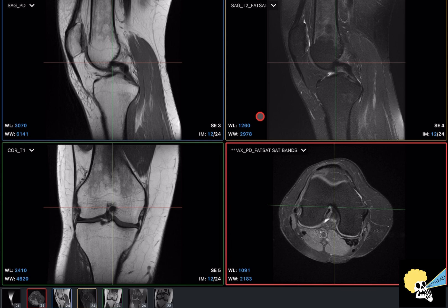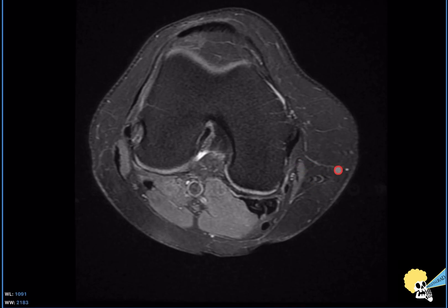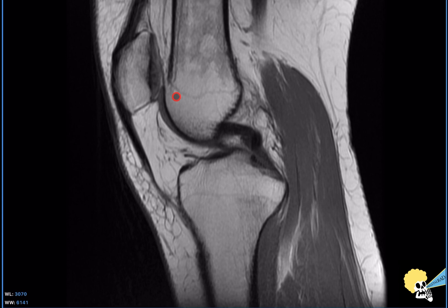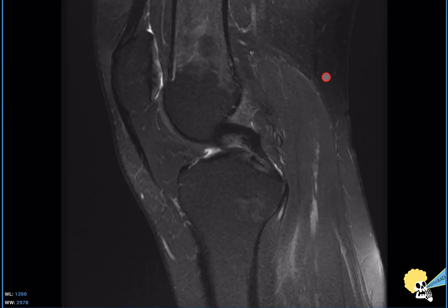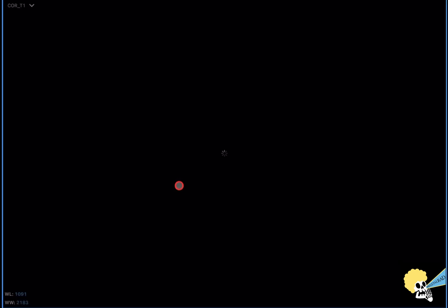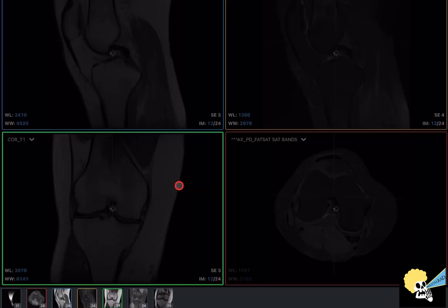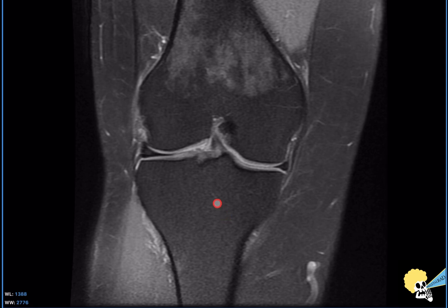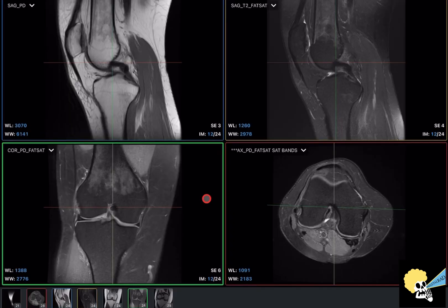The knee MRI usually has five sequences. There will be one axial image, which is usually a proton density with fat suppression. Then we have two sagittal images — one is a proton density without fat suppression and the second is either a T2 with fat suppression or a proton density with fat suppression. Then we have two coronal images. Most people will do a coronal T1 with no fat suppression, and the other will be a proton density or T2 with fat suppression. Having proton density in both coronal and sagittal allows you to evaluate the meniscus in the body, as well as the posterior horn and the anterior horn.